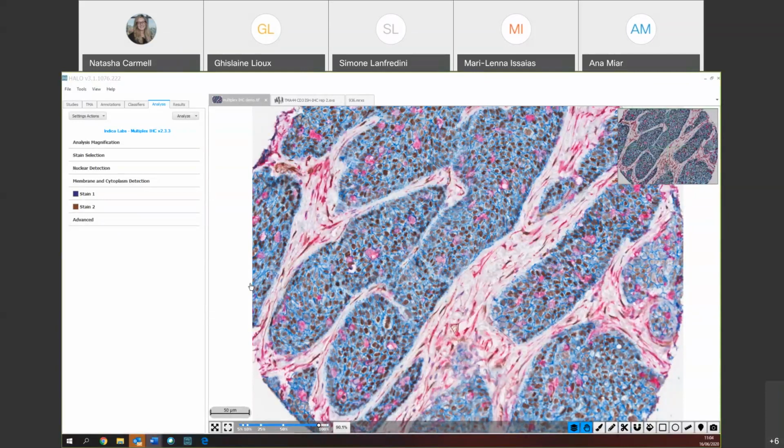So the algorithms we are going to touch upon today are all meant for cell segmentation, and each one of these is used for certain applications. Multiplex IHC is meant for cell segmentation according to protein markers in bright field, and the ISH IHC and FISH IF modules are meant for probe segmentation, but also have a component for protein markers as well. The ISH IHC module is used in bright field typically, and the FISH IF module is used in fluorescence.